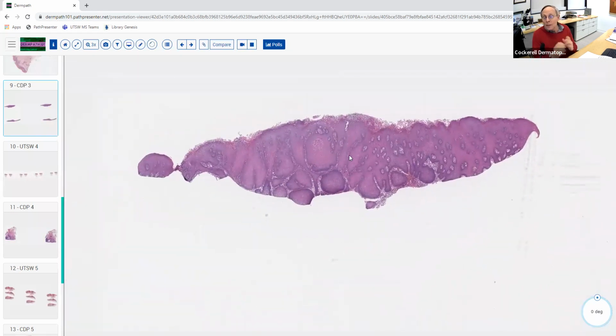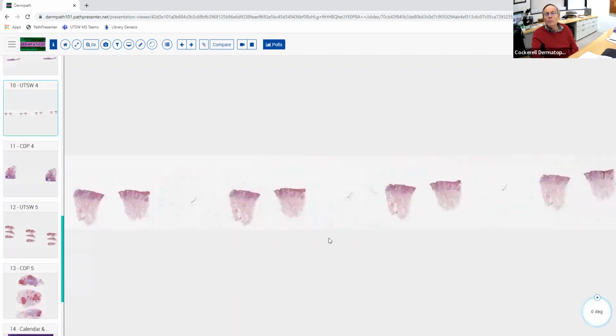So just remember the difference between Candida and Tinea. Tinea likes to live horizontally like this. Candida likes to go down this way. Candida, you won't usually see spores. You'll see the little yeast. Whereas in dermatophytes, you may see some chlamydospores up there. You may just see mostly hyphal elements. Also, you're on mucous membranes more commonly in Candida versus a dermatophyte.